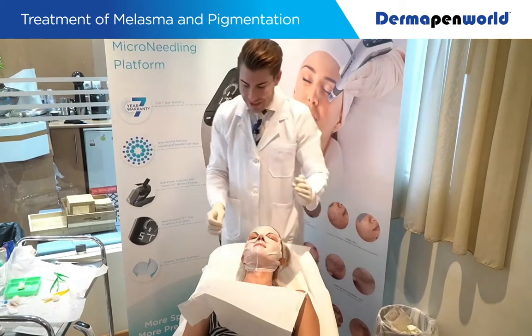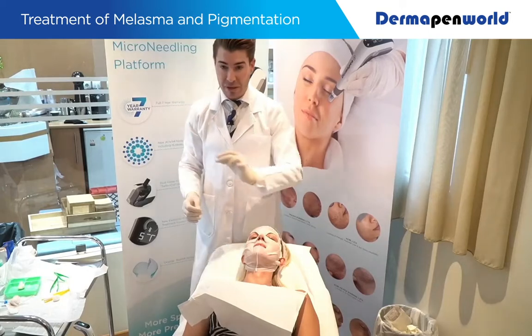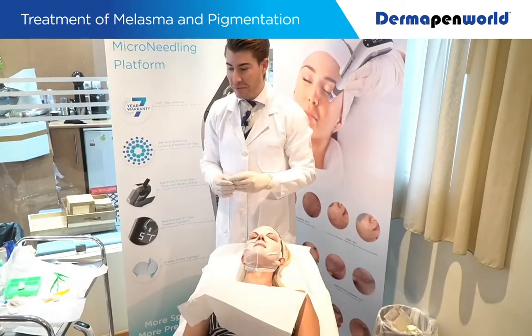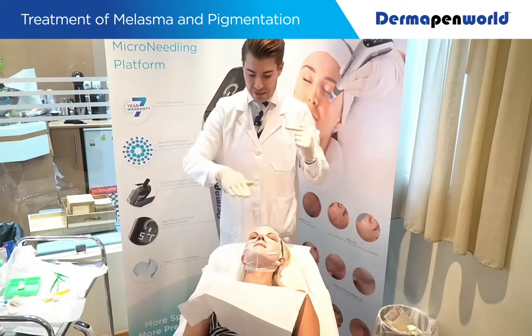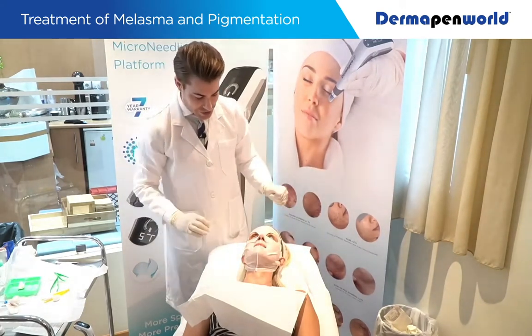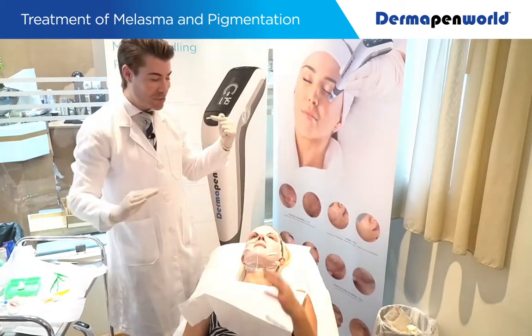Okay. The second reason why I put the mask on is psychologically, the patient's last memory is Zen and connectivity with you as the practitioner. So instead of you just put needles in my face and then you put chemical peel over the top, their last moment is this. So I'm going to get you to have a chat. Greek is fine, no English required. I can't understand Greek, so you get to say whatever you want.